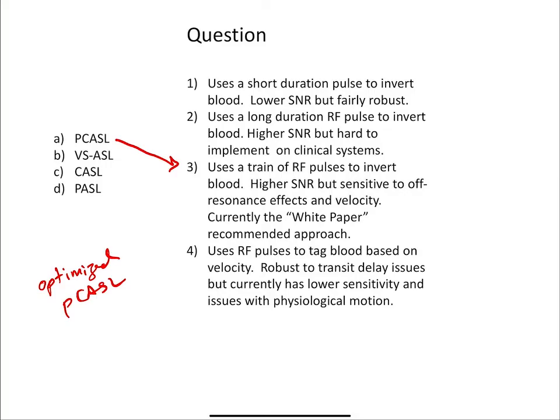Okay, and also the other thing is we'll talk a little bit later about doing functional MRI with ASL. A lot of scans will just maybe do 5 or 10 minutes of ASL, in which case you don't necessarily want to go to the trouble of correcting for all these issues. But if your whole study is based on ASL, let's say you're going to do an hour of ASL, then it becomes worth it to spend 5 minutes making sure you're really correcting for these issues before you spend the next 60 minutes correcting bad data. Okay, so there are trade-offs in terms of even ASL.